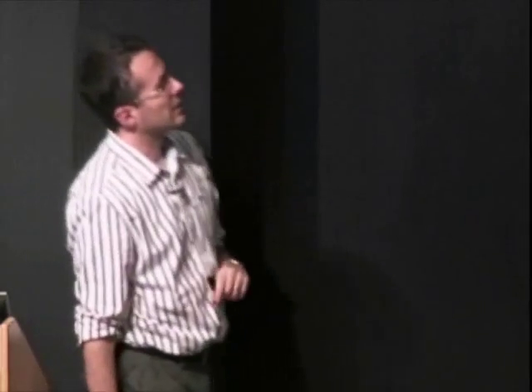And we do have something that helps, and this tool, as crummy as it might look, it is already being used at Addenbrooke's. Sorry, Antonio, is it error-prone as well? Are there lots of mistakes with the manual segmentation? Absolutely, absolutely. So because of tiredness and everything else, you tend to make mistakes. Hopefully not too many, but that's just the nature of things.